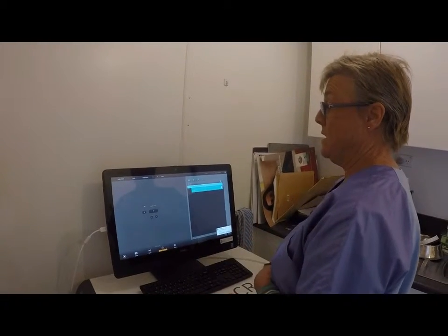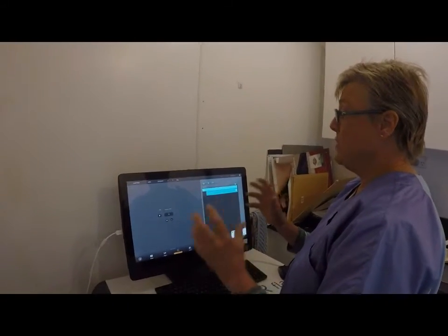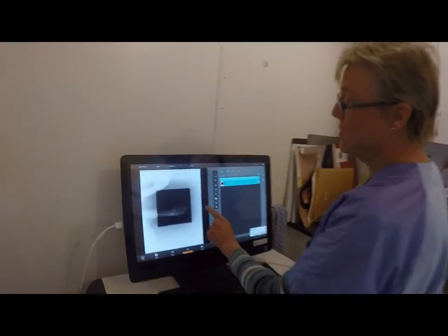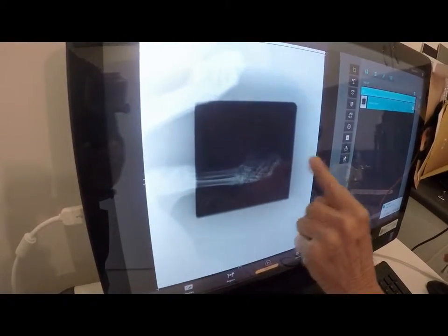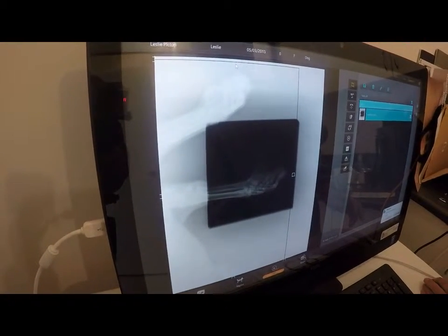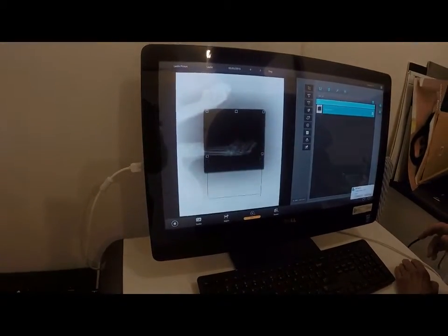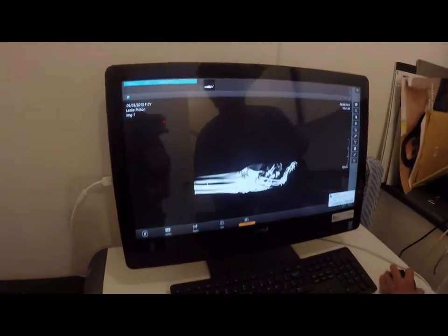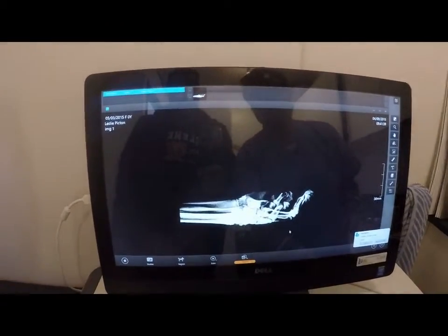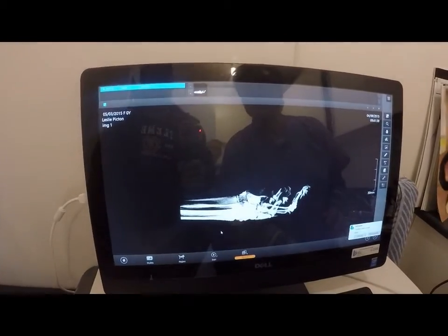Afterwards it takes that information up and then wipes the slate clean — quite literally. So now at this stage the cassette is being wiped clean, a bit like a Magna Doodle for those people that had those drawing machines that you'd shake to start again. Now this is a touchscreen machine so we will crop the image, which makes it more accurate and gets a better definition of the area of interest, which is the foot of this dog. Then we review it and it can be changed up or down depending on how light or dark you actually want it. And that's our x-ray processing.